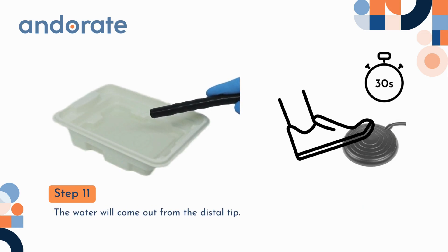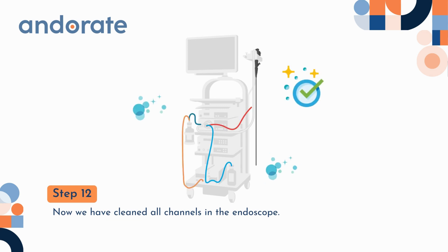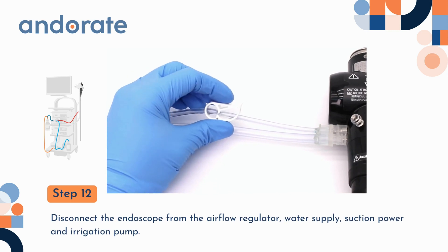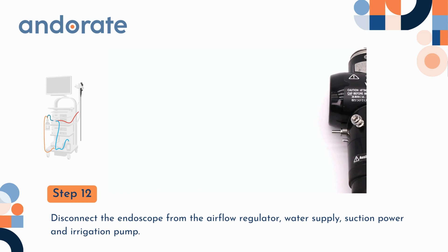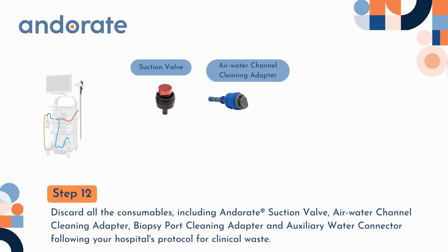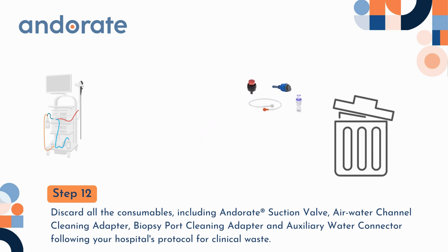The water will come out from the distal tip. Step 12. Now we have cleaned all channels in the endoscope. Clamp the air water bottle tubing. Disconnect the endoscope from the airflow regulator, water supply, suction power, and irrigation pump. Discard all the consumables, including Andorate suction valve, air water channel cleaning adapter, biopsy port cleaning adapter, and auxiliary water connector, following your hospital's protocol for clinical waste.